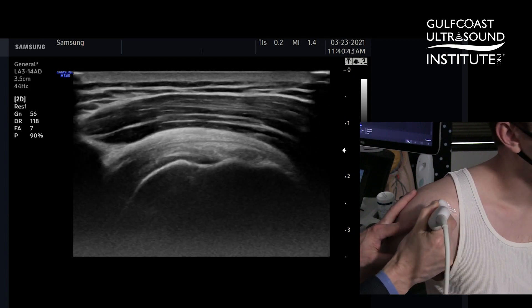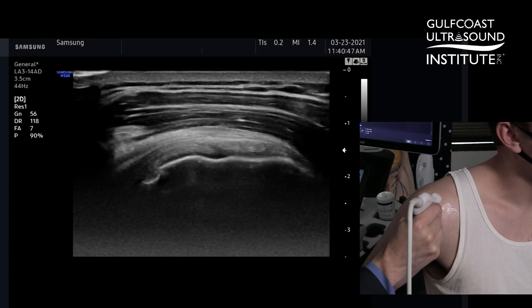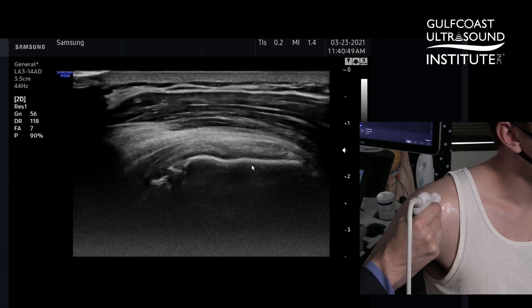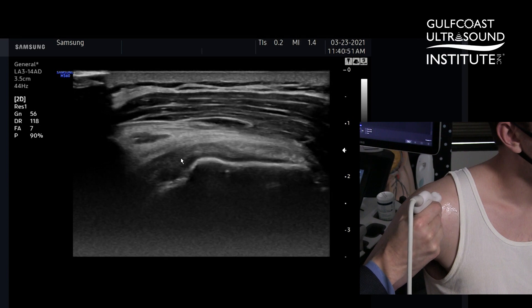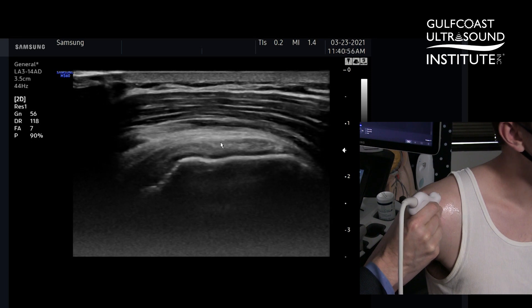As I move more posterior, you'll see the bone contour flatten out. That will tell me that this is now the middle facet, which is where we see the supraspinatus attaching here and the overlap of the infraspinatus shown here.